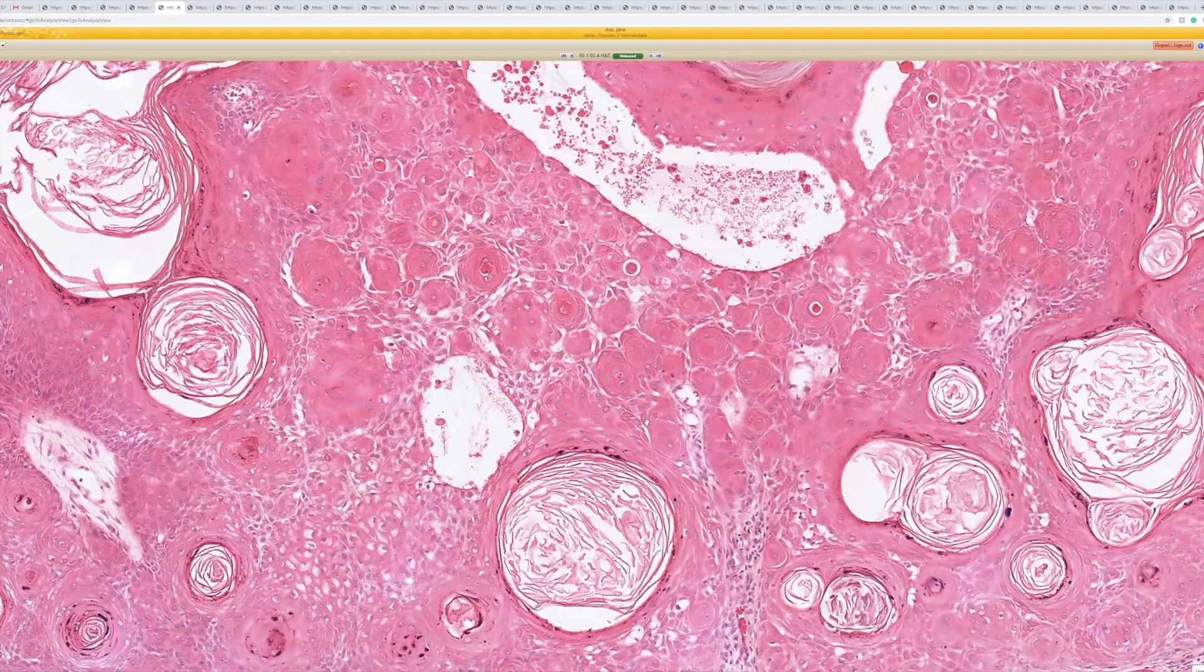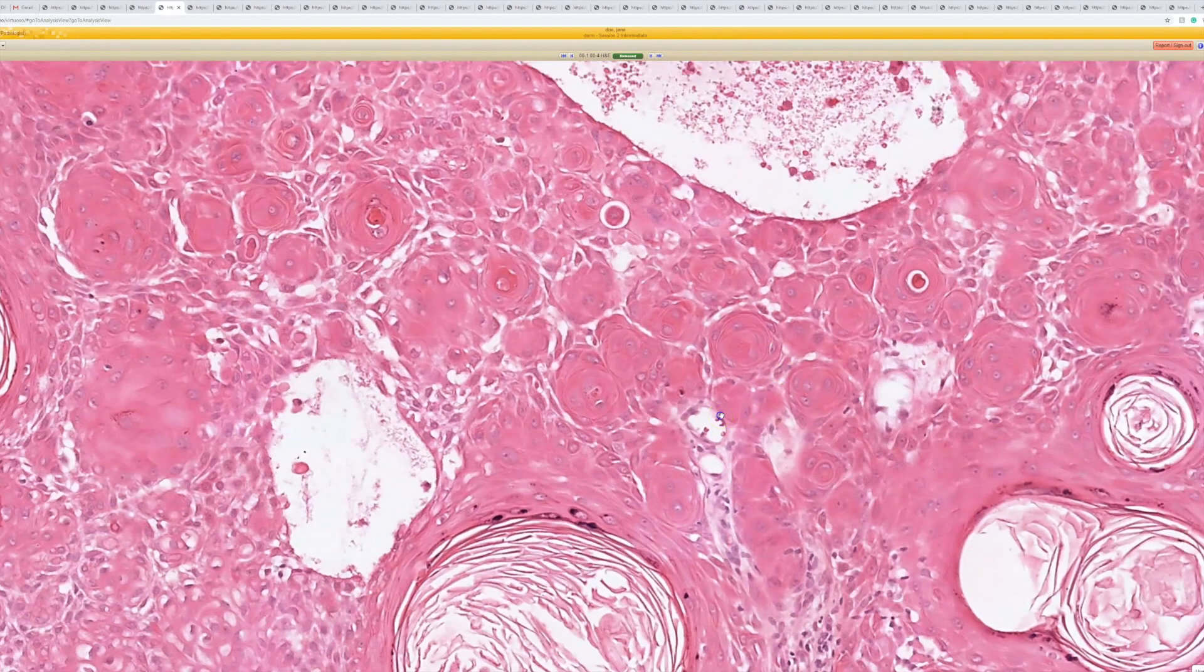Inverted follicular keratosis looks a lot like this. To me, they're probably either closely related on a spectrum with one another. It's like an irritated seb that's just grown and bulged downward into a hair follicle, then that's what an inverted follicular keratosis is. They have these same swirled, whirled squamous eddies.